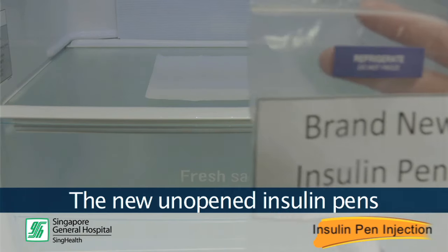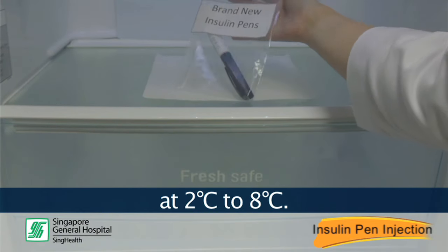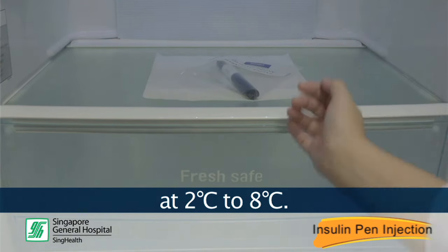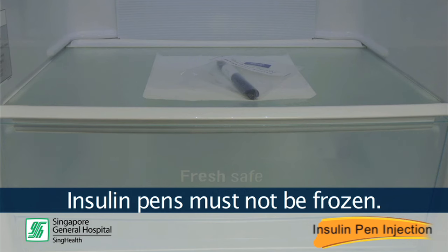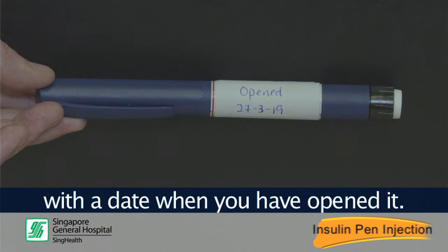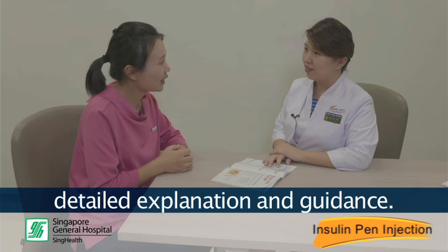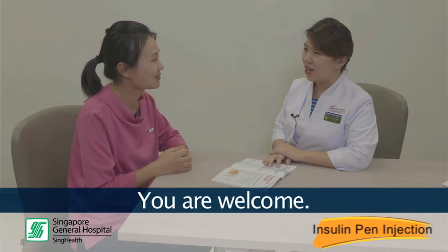The new unopened insulin pens are to be stored in a refrigerator at 2 to 8 degrees Celsius. Insulin pens must not be frozen. Do remember to label each pen with the date when you have opened it. Expired insulin must not be used. Thank you, Ms. Hui Feng, for the detailed explanation and guidance. You are welcome.